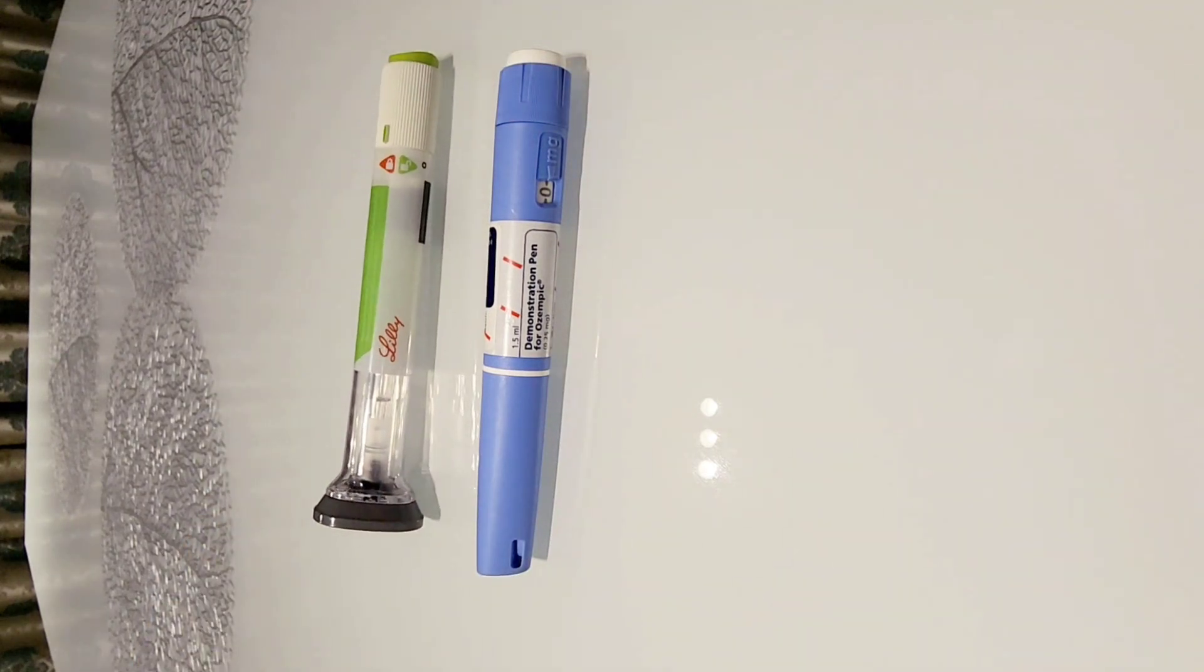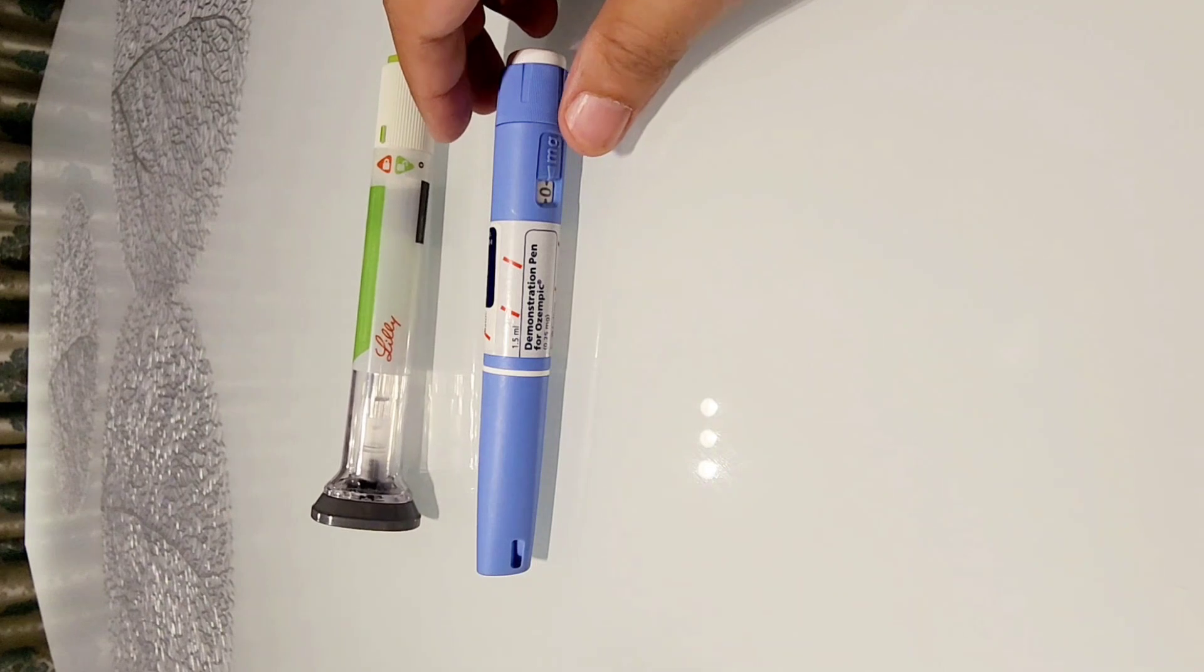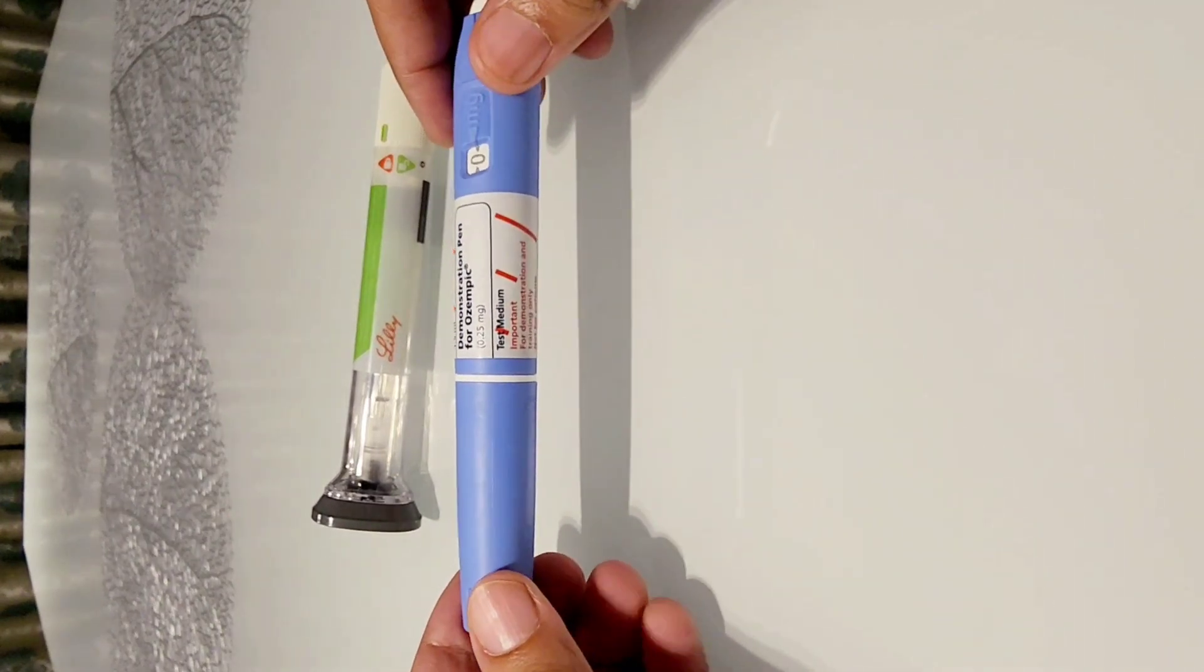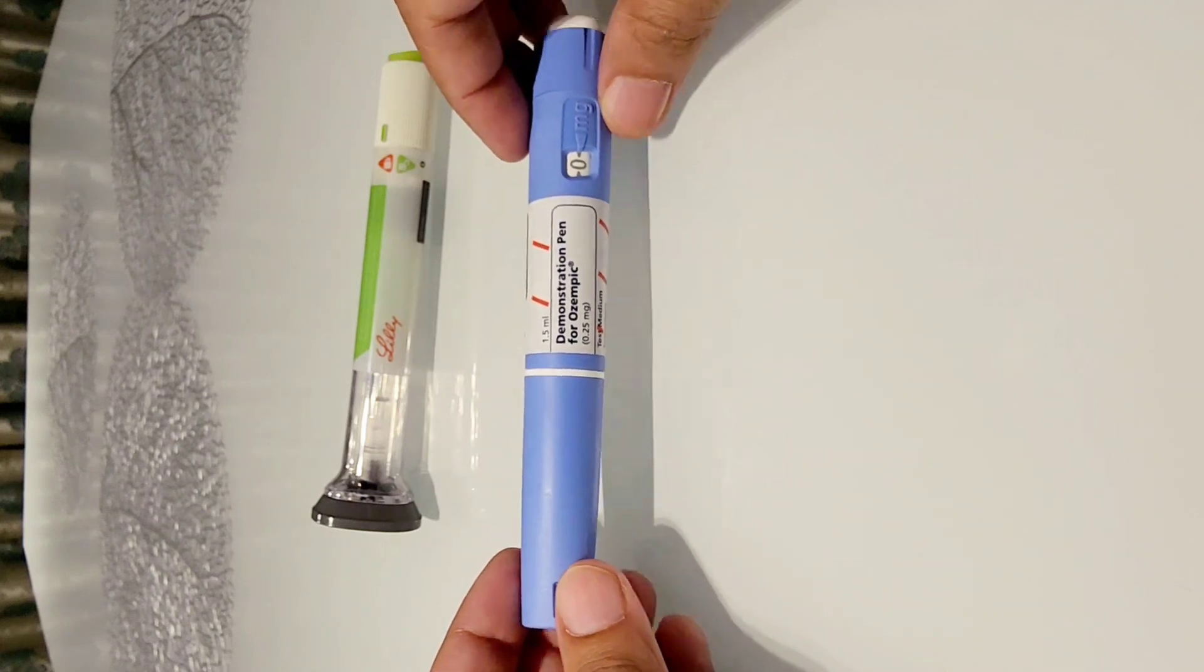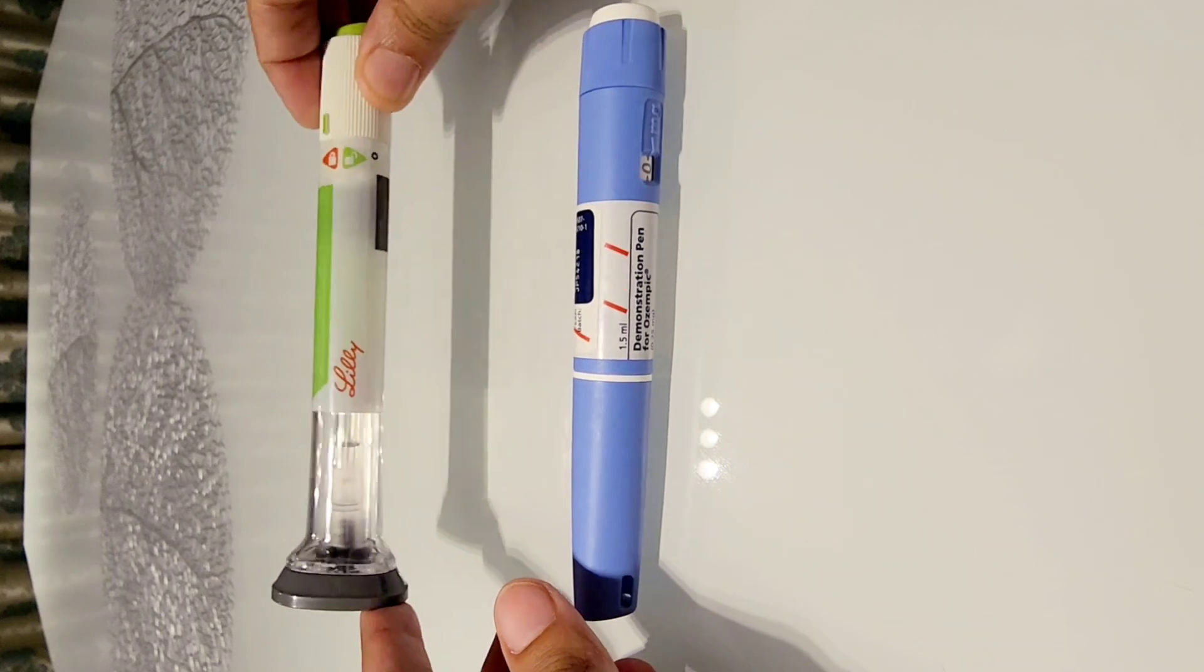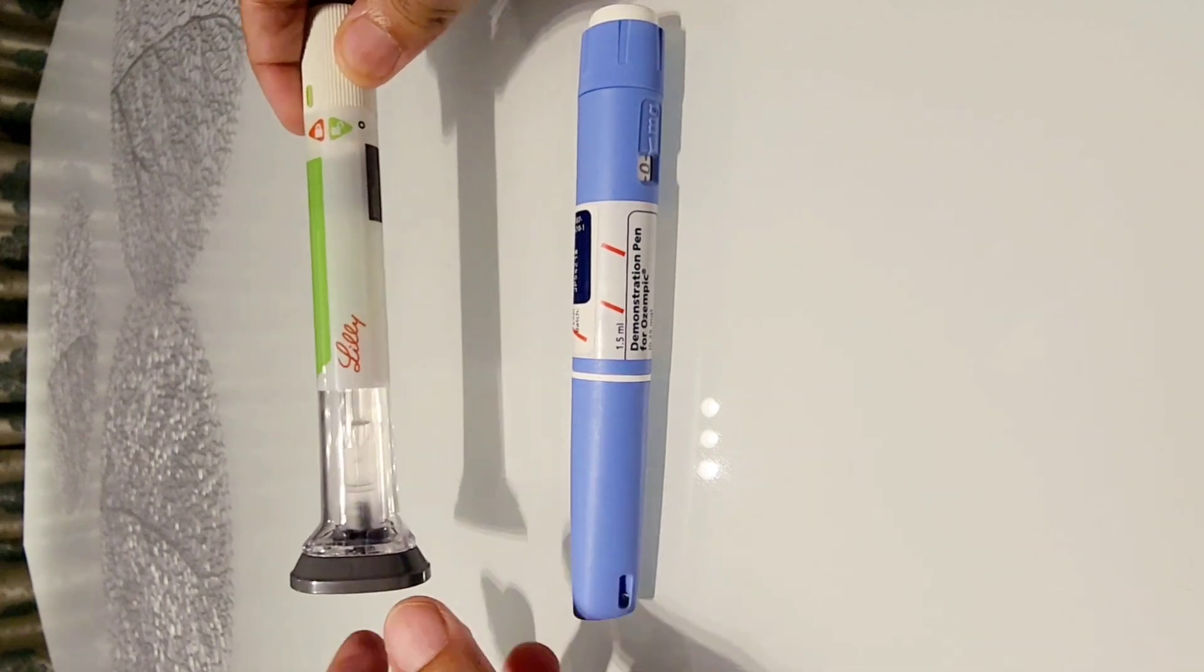Now the difference is quite significant because Ozempic will give you four dosages over a period of one month whereas Manjaro will give you just one dose per week and this is a single-use disposable pen device.